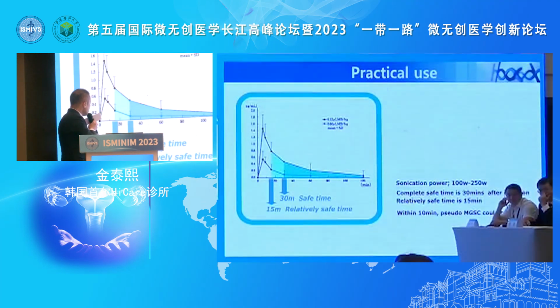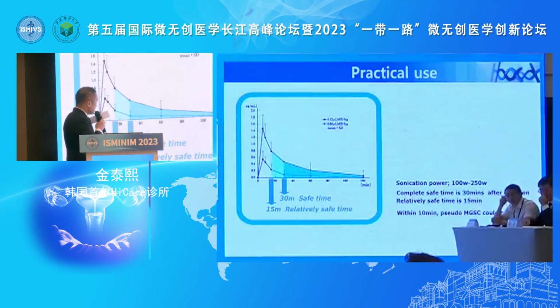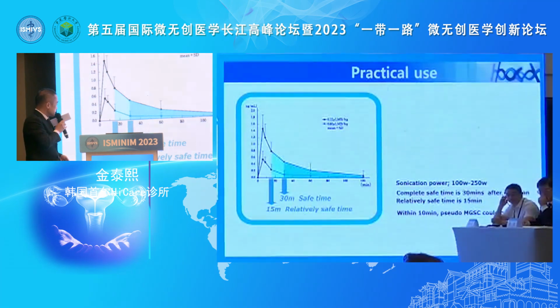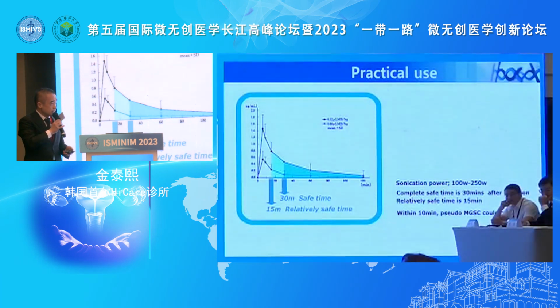For practical use, the completely safe time was 30 minutes after the injection. About 15 minutes is a relatively safe time, and in my experience, when I used sonication after 10 minutes or 5 minutes, sometimes I could see pseudo-lesions.